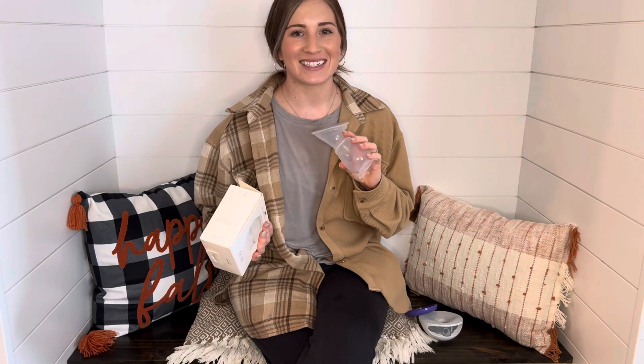Good afternoon guys, my name is Brooke. I'm going to talk about the LV Curve and the Haakaa. I'm guessing if you clicked on this video you're very curious as to which one to use, how to use them, and which one I prefer. So if you want to learn more, stay tuned.